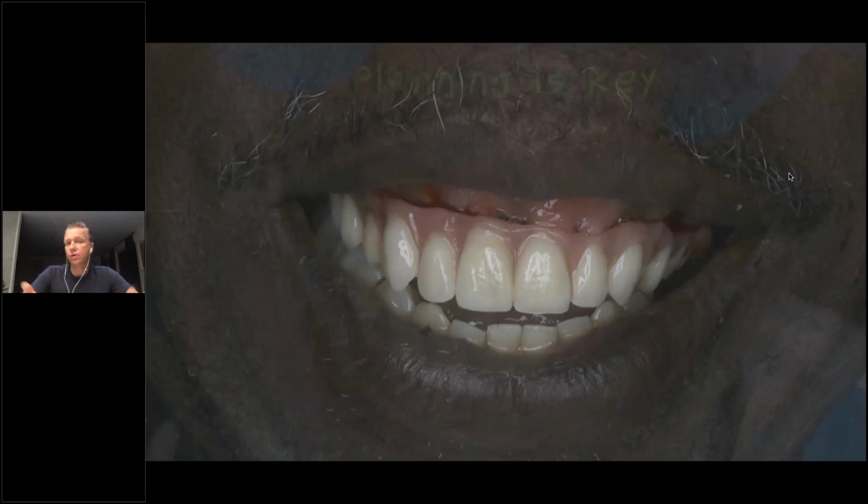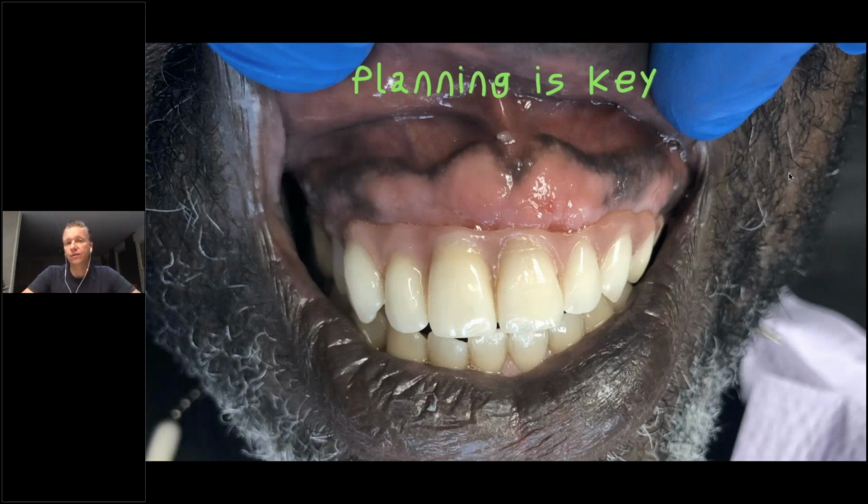The same case, totally retracted, chairside, for a quick snapshot. I describe this as a total aesthetic and functional disaster. That's unfortunately where some people end up, and we see these cases a lot, helping the treatment team to fix them.